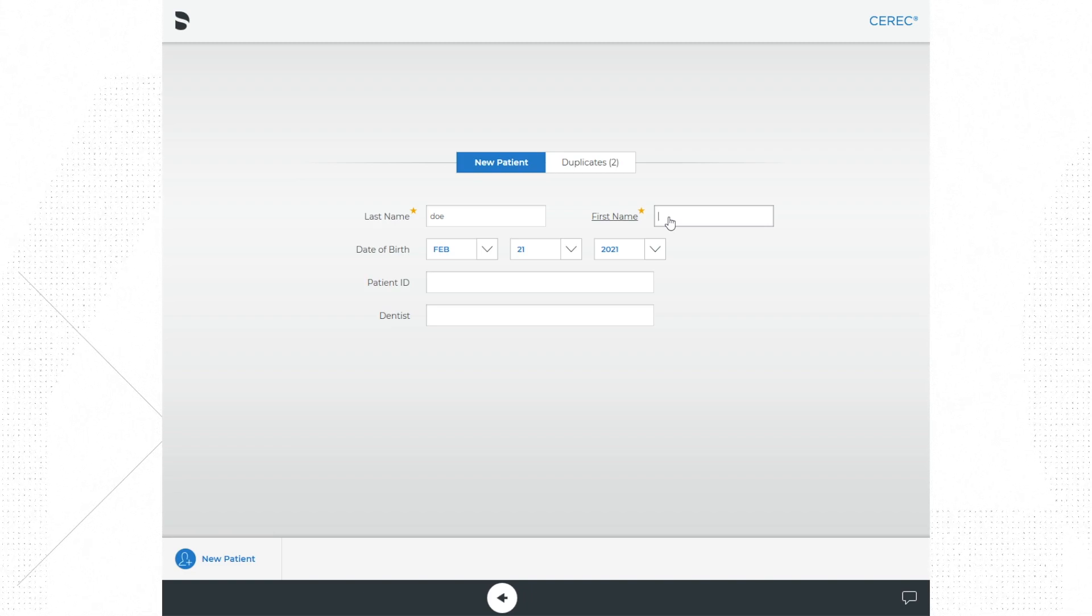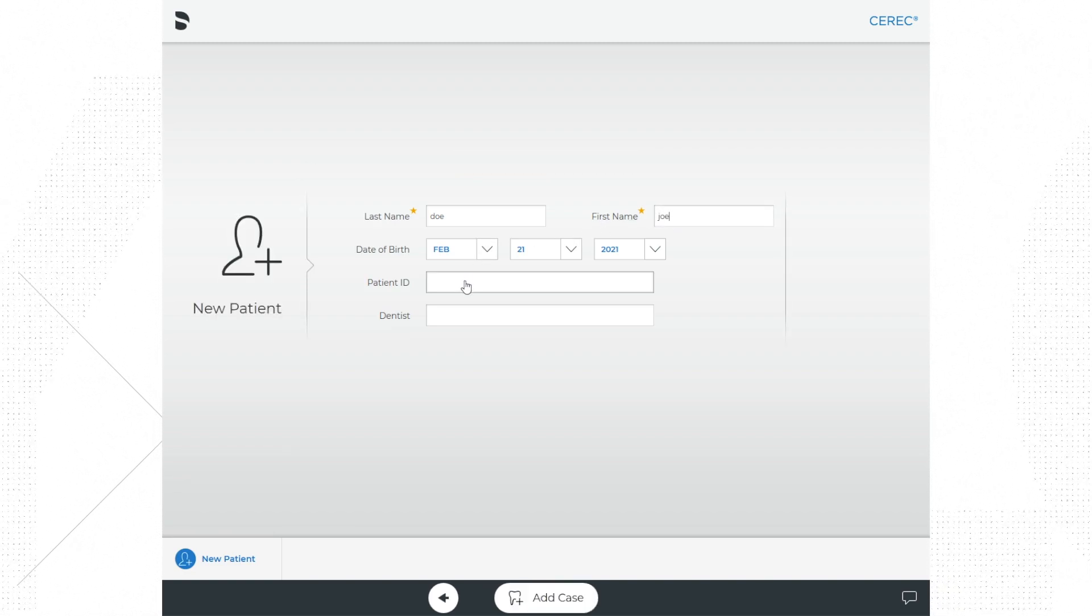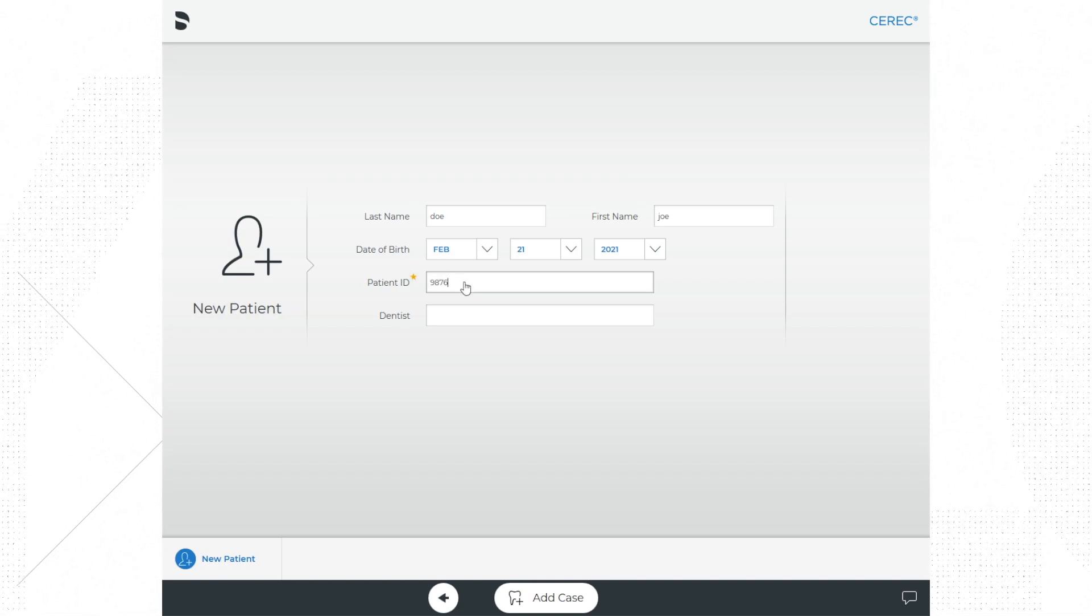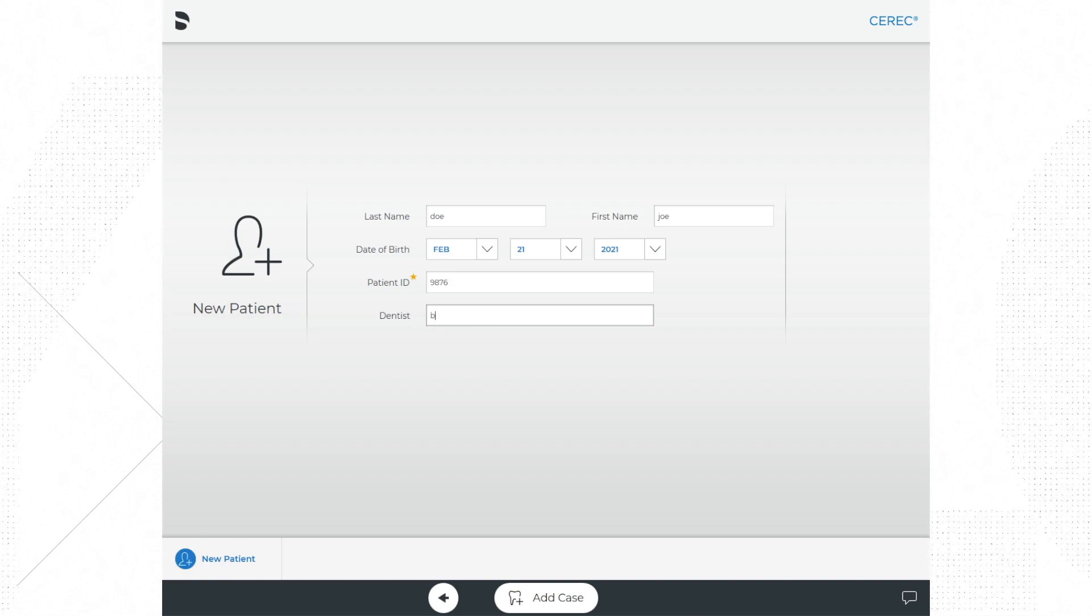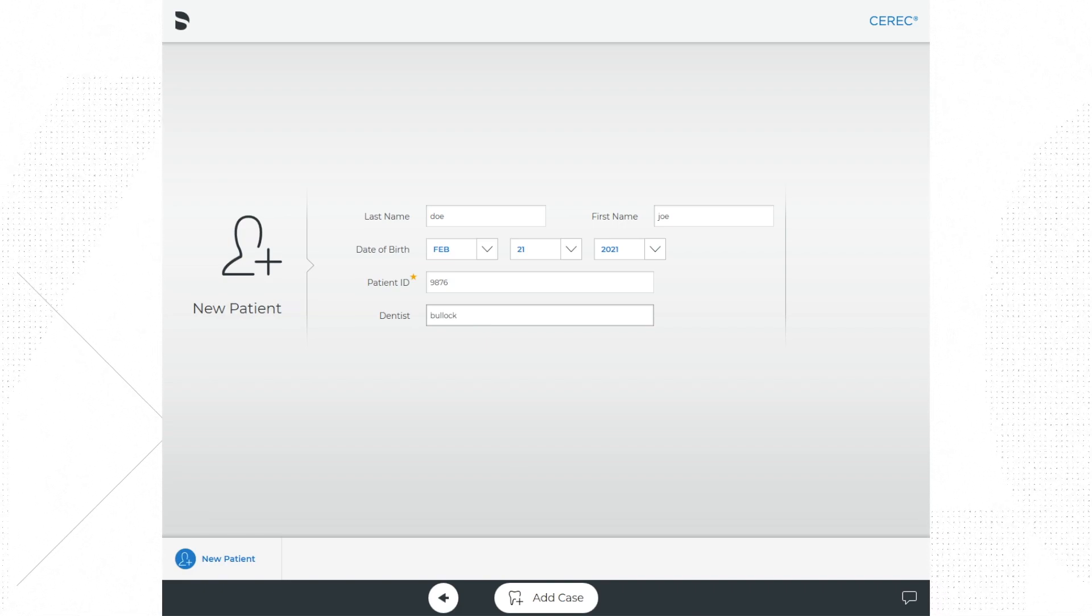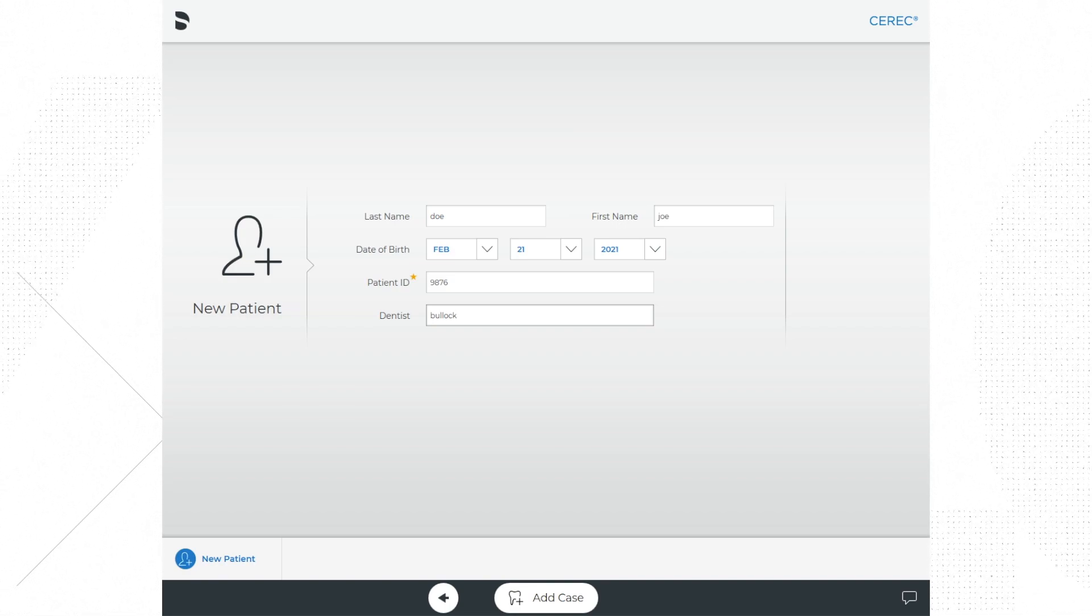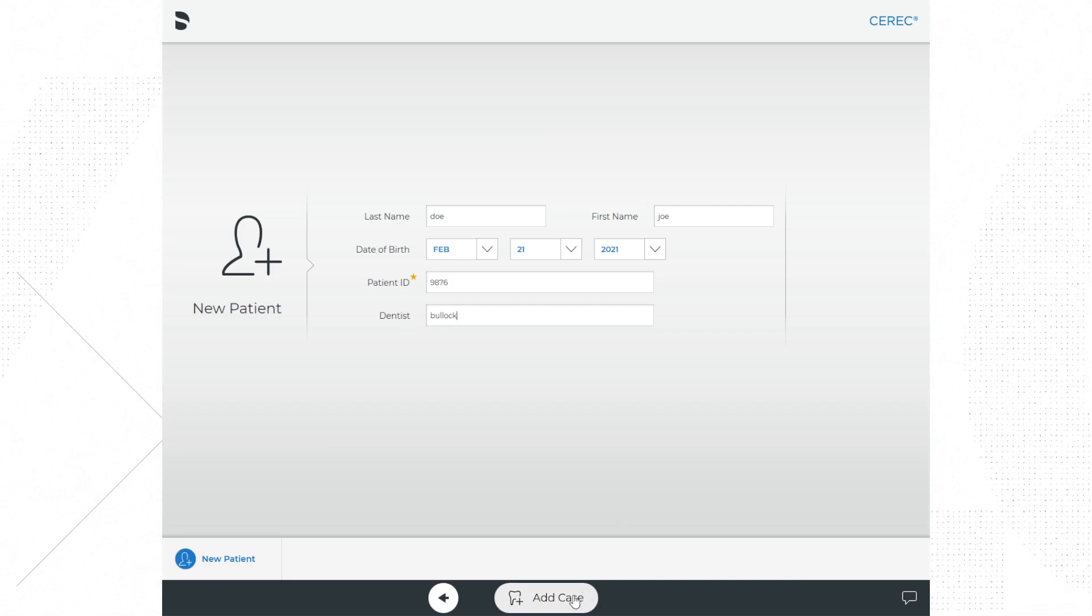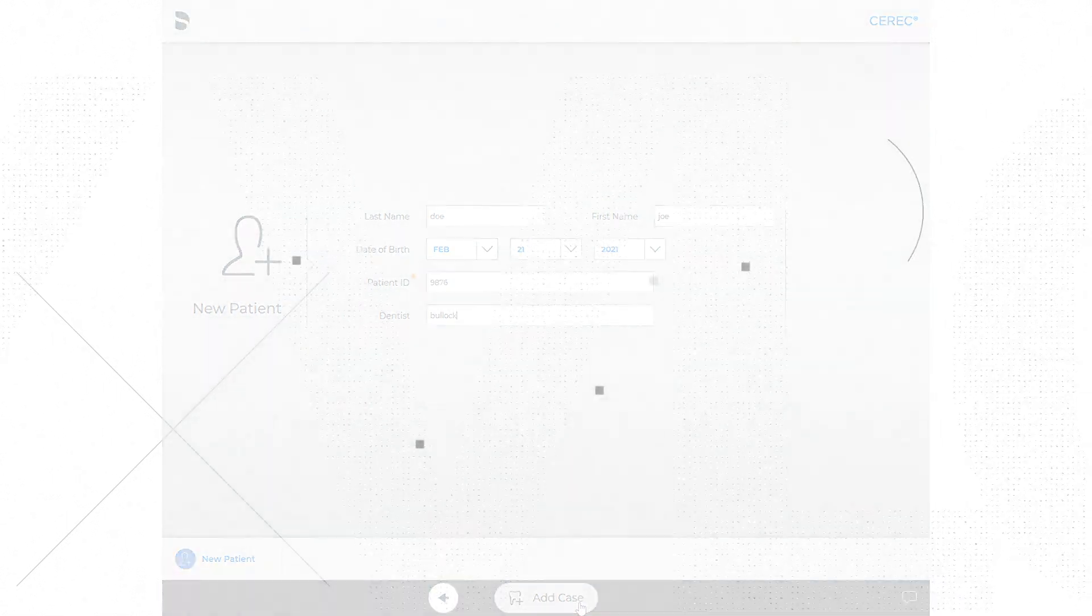Last name can be Doe, and first name can be John or any similar variation for our fake patient. You do not need to change the date of birth if you don't want to, and the patient ID can be 1234. For dentist, just put in your last name. After you have all that information entered, go ahead and click on add case at the bottom of the screen.